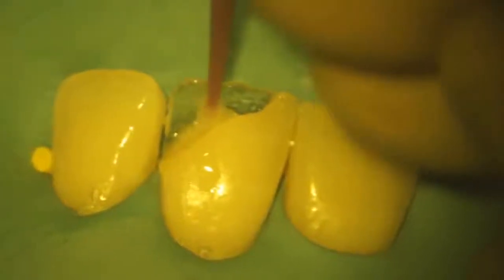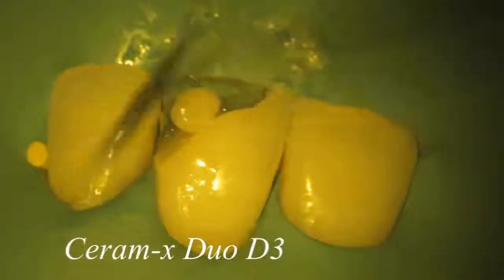And I'd like to mention in the very beginning that there is nothing bad in using of wetting resin at the stage of modeling and applying of composite, even between the layers, even inside restoration. But you need to understand that you can use only special kinds of modeling hydrophobic resin which was developed directly for composite restoration. And it is strictly prohibited to use as one of the alternative agents any kinds of adhesive system of the 5th, 6th, and 7th generation.